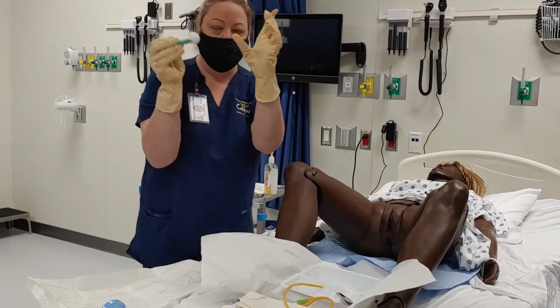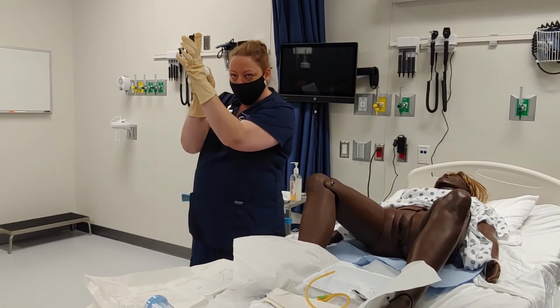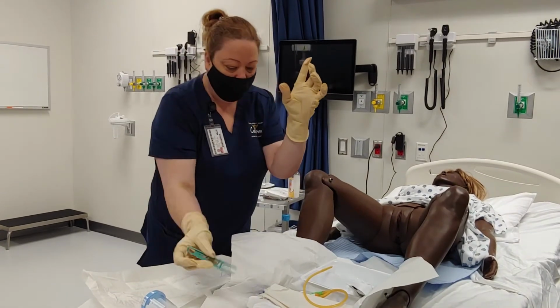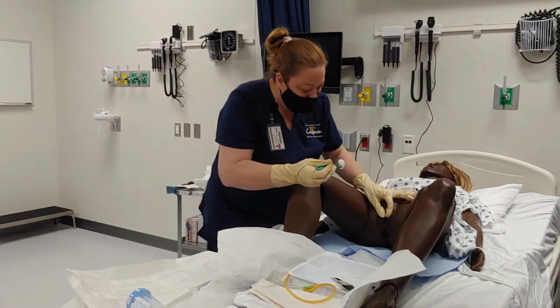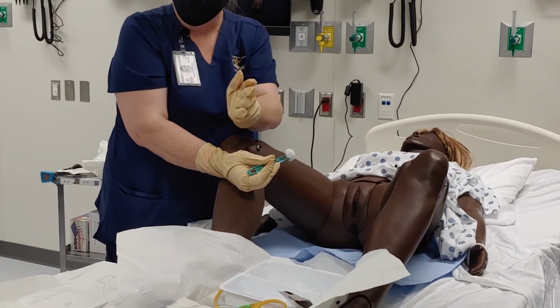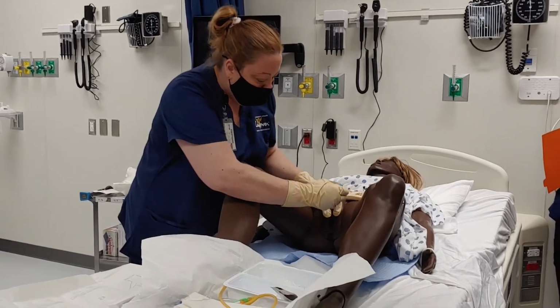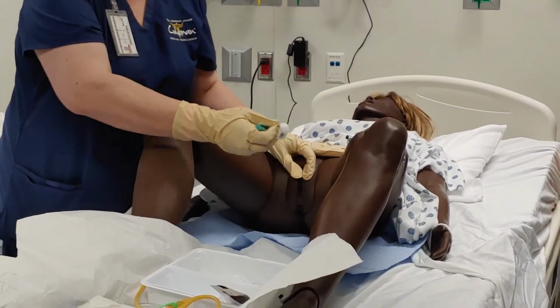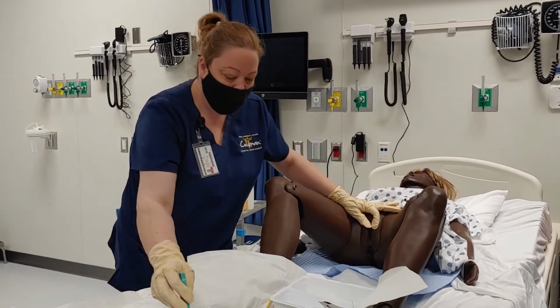I'm going to take the next one. I'm going to wipe down the other side from front to back. Get rid of that one. Then I'm going to take the last one and I'm going to go straight down the middle of the opening to where it's going to go across the urethra. So I'm going to take that and swipe straight down the middle. Again, front to back. Always, always front to back.